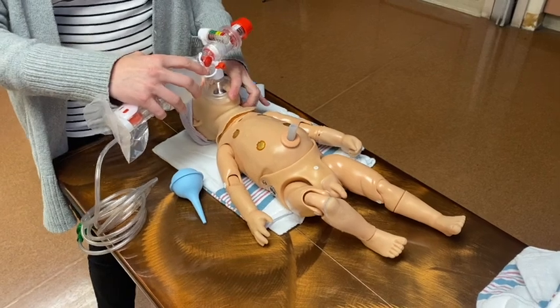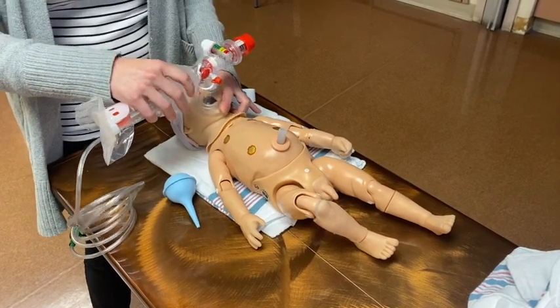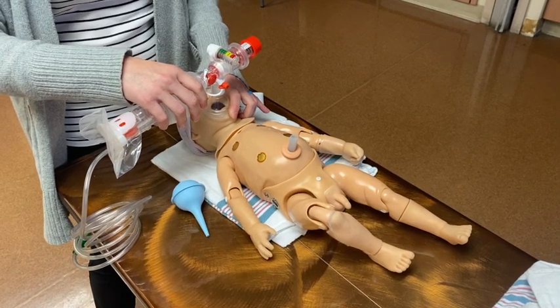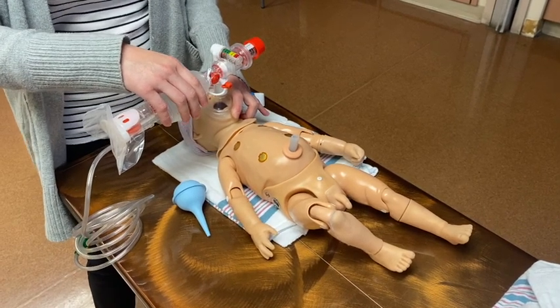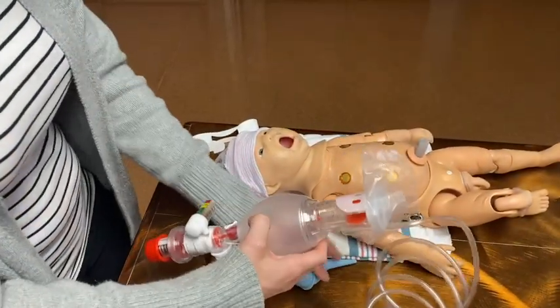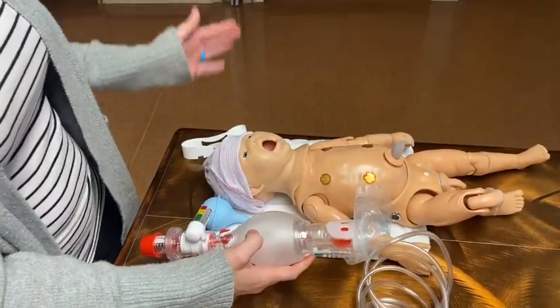Make sure you have a good seal. Little babies really don't need a lot of pressure. Then you're going to deliver breaths in a waltz pattern for positive pressure ventilation — so it's: breathe, 2, 3, breathe, 2, 3, breathe, 2, 3. Then you can suction again — mouth first, then nose. You can open the mouth and get a nice sniffing position.